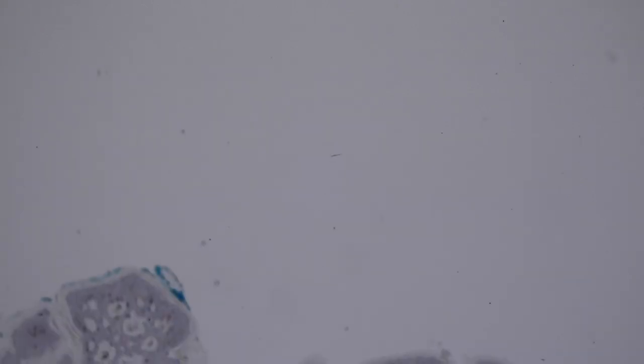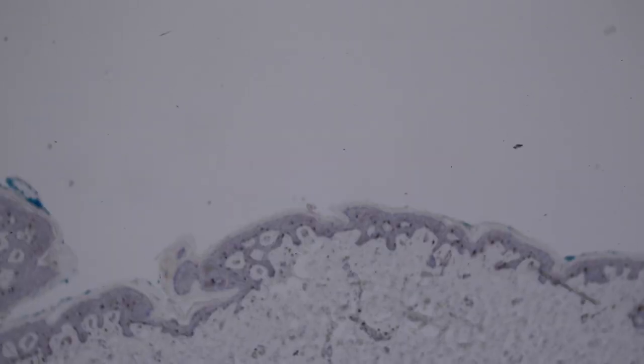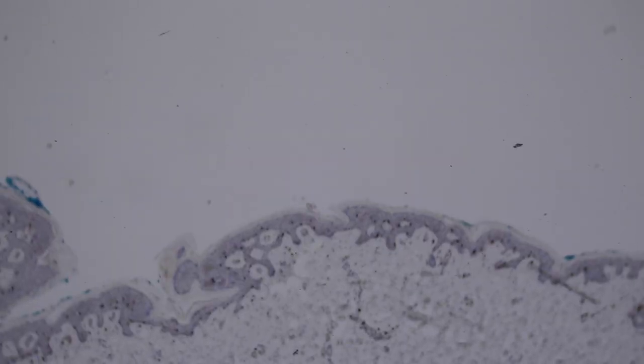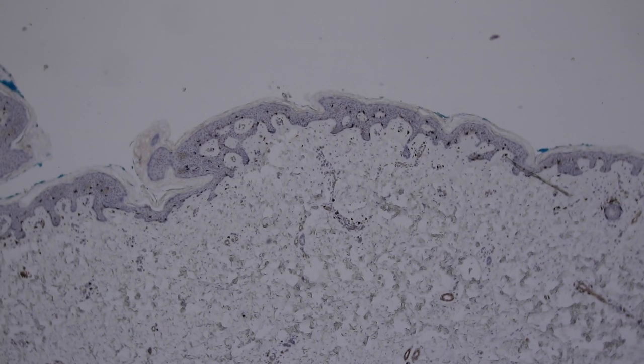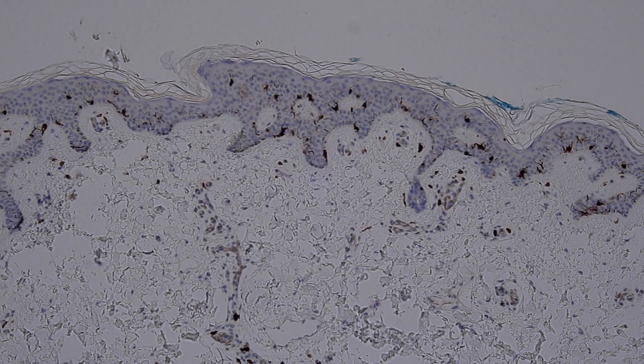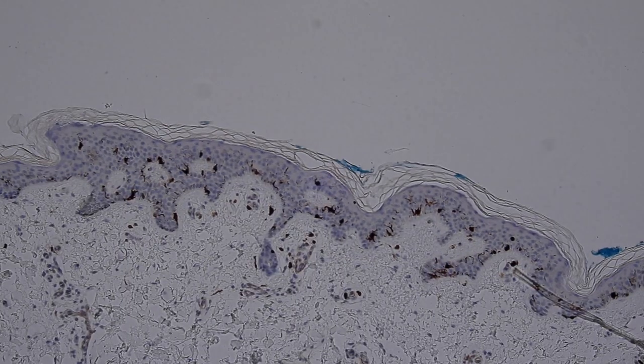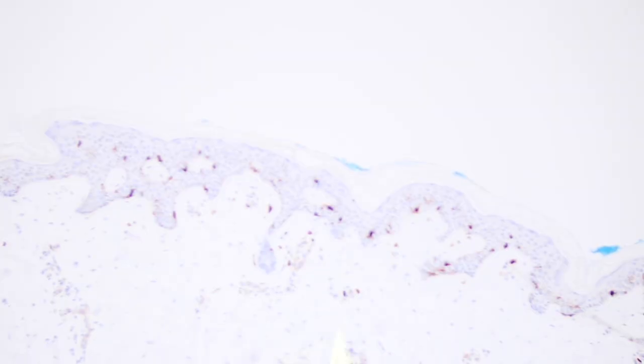So the next thing we're going to look at is S100 protein. The reason I'm showing you S100 protein is that it stains nerve and some other things, and it stains melanocytes in the epidermis, so it will stain melanocytes along the basal layer, these little guys down at the bottom here.